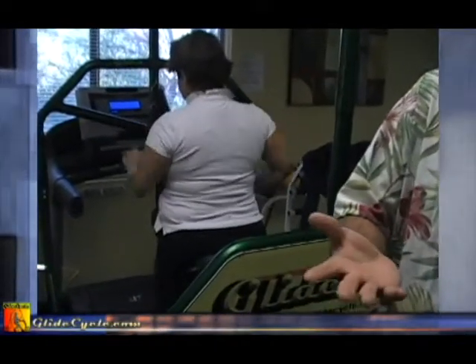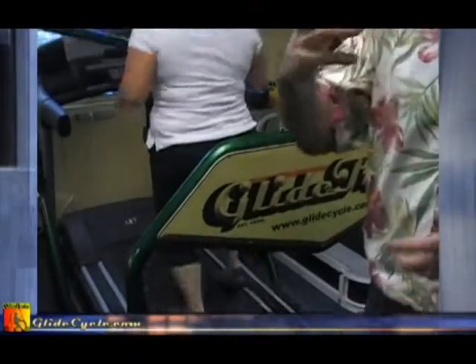Sure. Well, let's say a doctor sends us a patient and writes toe touch weight bearing or partial weight bearing. We might call the doctor and see exactly what that means as far as a percentage of their body weight. And we act accordingly, and this GlideTrak works to lift that person's weight off their feet to a certain point, even to toe touch weight bearing, and allow them to still have the motion, the benefits of their cardio workout, and get the motion going in the joints, get the joints lubricated without violating that weight-bearing precaution, without causing stress to arthritic joints or joints that may have suffered a fracture.